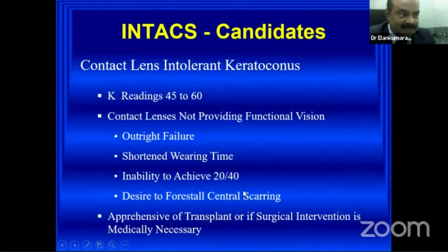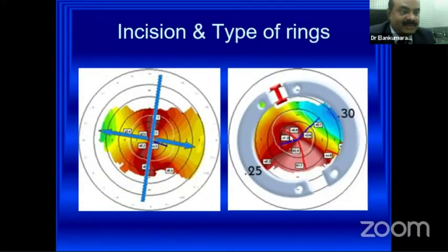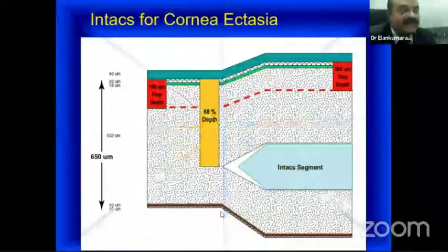That's what this does. And these are the patients whom you can think about an intracorneal ring segment. In short, if I have to tell something here, an intracorneal ring segment is for a person who has an irregular keratoconus. Asymmetricity is more. However, it can be used anywhere to bring the cone to the center. We have different types of ring. In the first case here, we can use a symmetrical 2 rings. In the second case, we have to use asymmetric or a single ring.